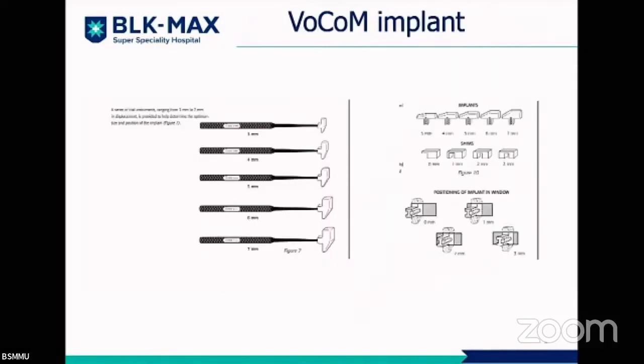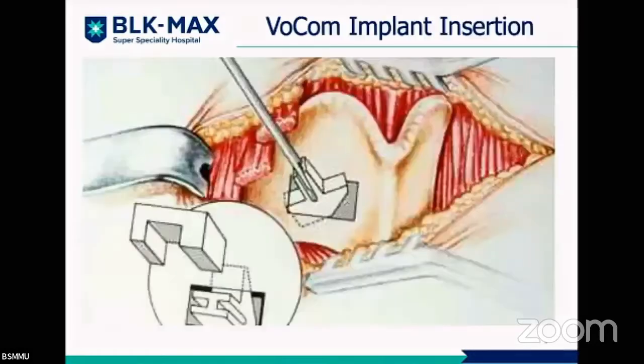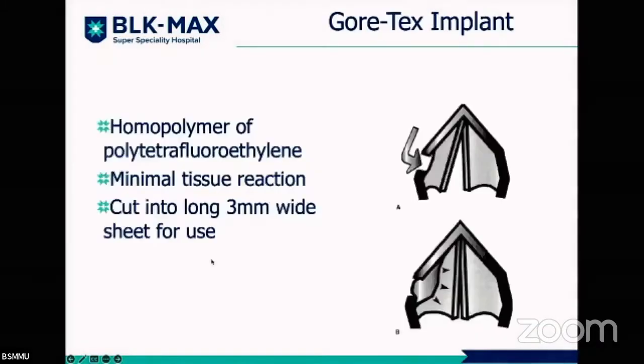Vocom, it has not come to India. It's just for academic interest I'm showing you, because it has got a self-locking system. There is a locking mechanism to prevent extrusion.